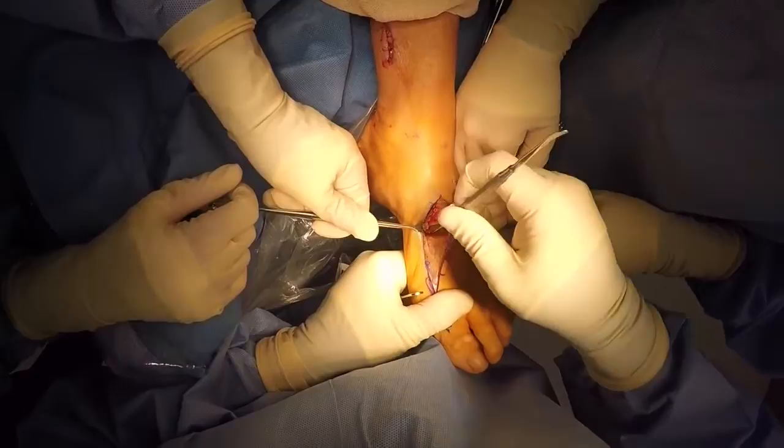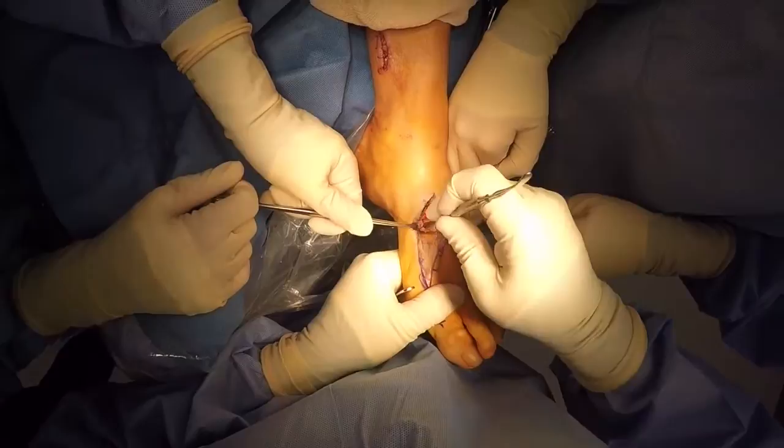In our case, this is our lucky day, and we're able to remove most of the bone fragments without too much difficulty. Plantar lateral first metatarsal, what is that?